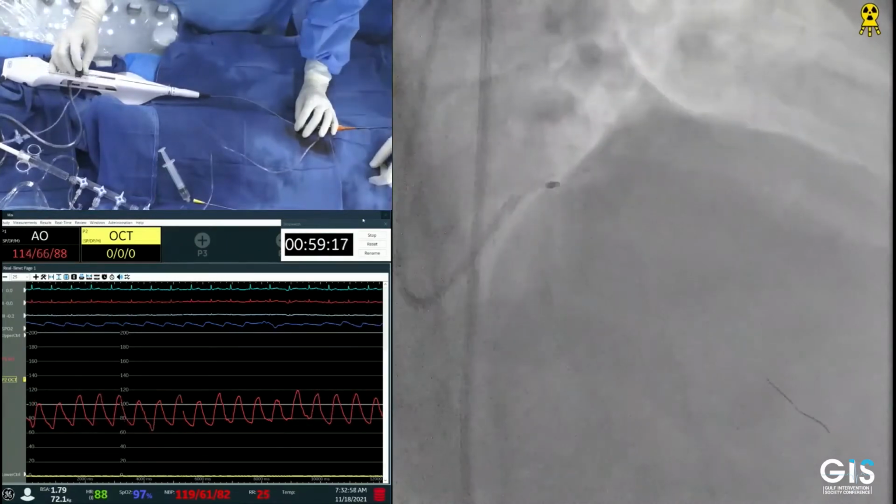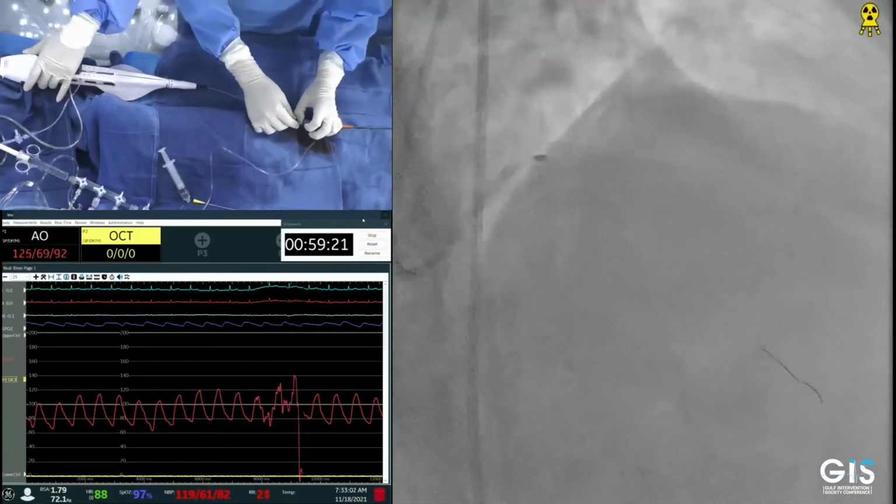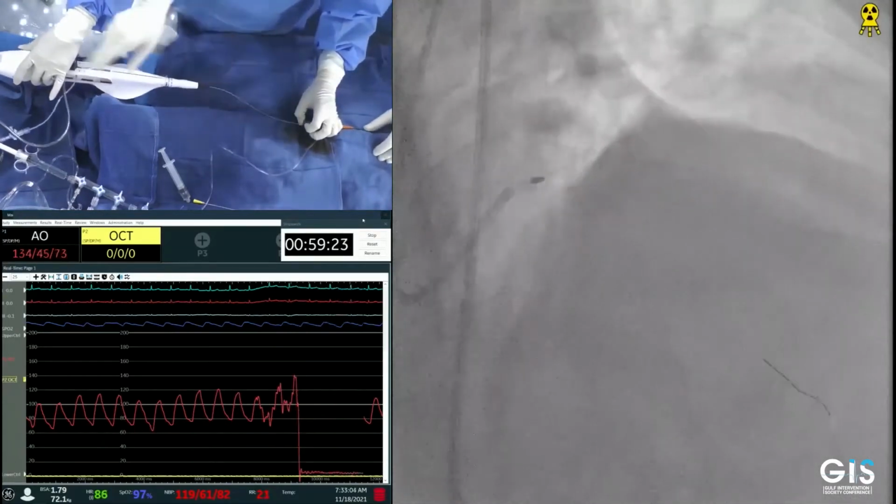I think we're good. Okay, run. So we do a little run through afterwards, a polish in the end, in and out a few times, yes. And that's sort of the end of the run.